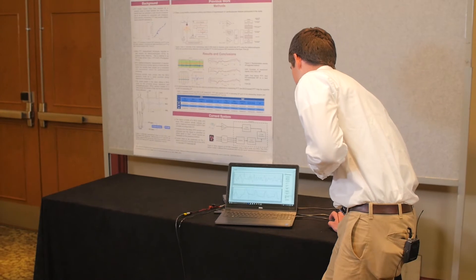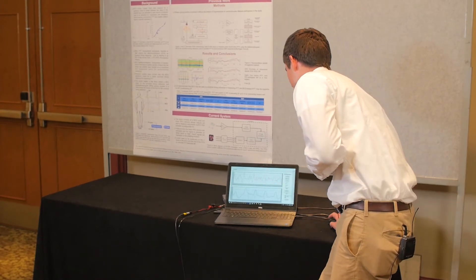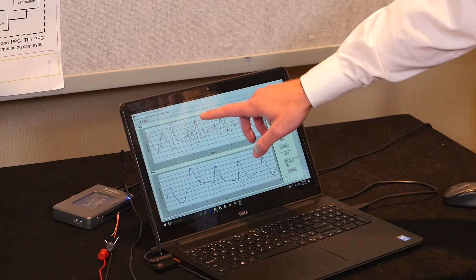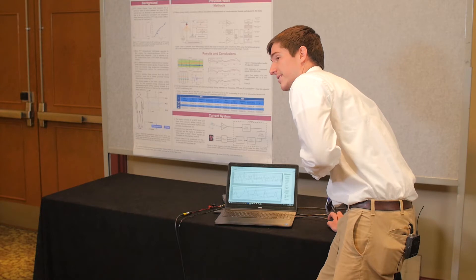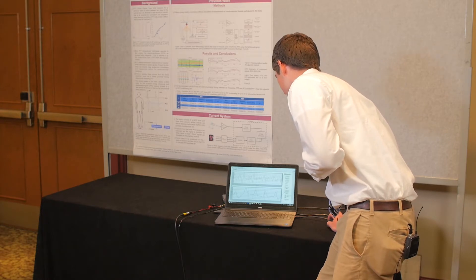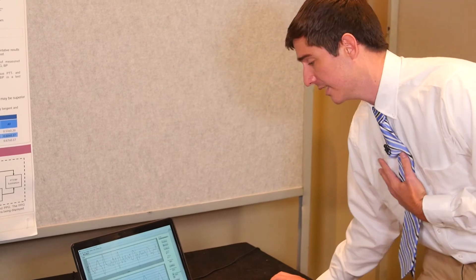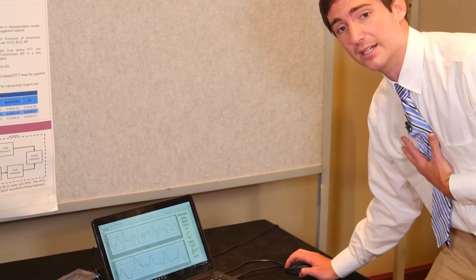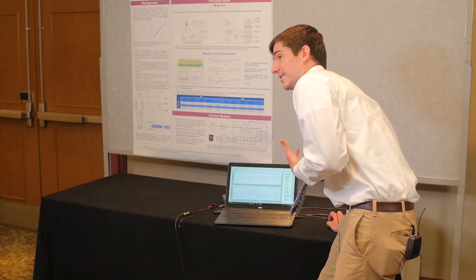The BCG waveform is indicated right here. It is composed of an IJK wave. We've proven that the I wave actually represents the cardiac ejection of blood, so we use that as the more proximal timing reference. We've moved the cursor right over it. And with the PPG, the foot of the PPG, which is the initial onset of this pulse wave, represents that more distal timing reference.